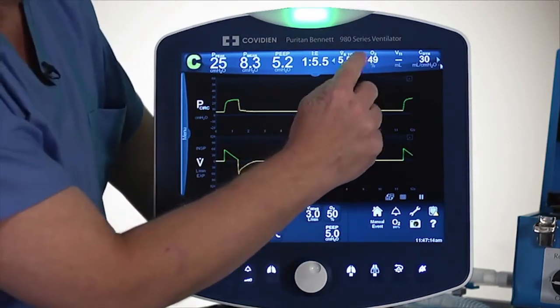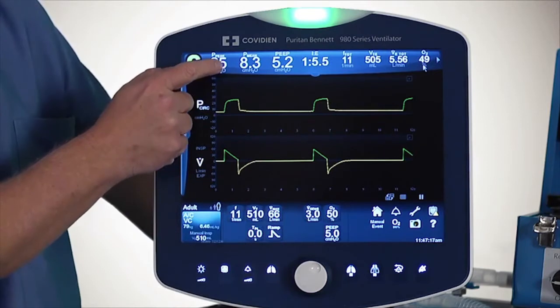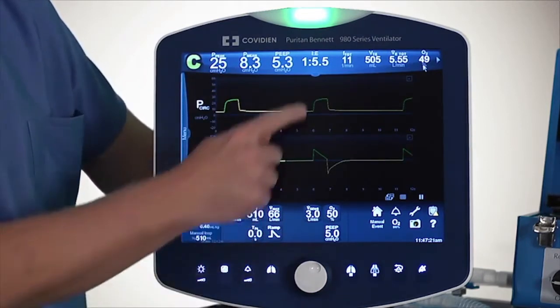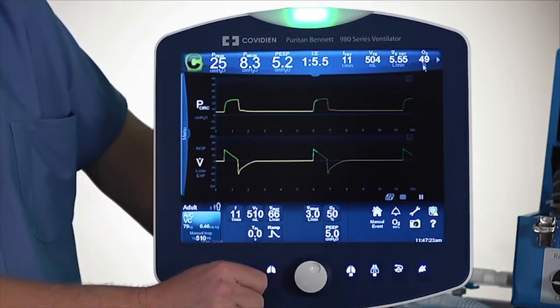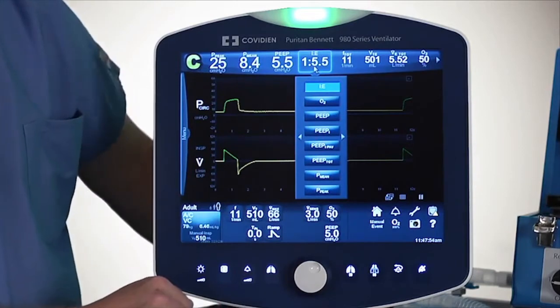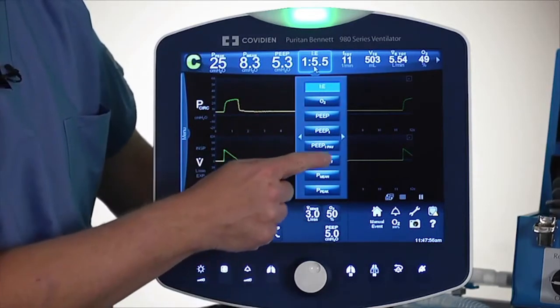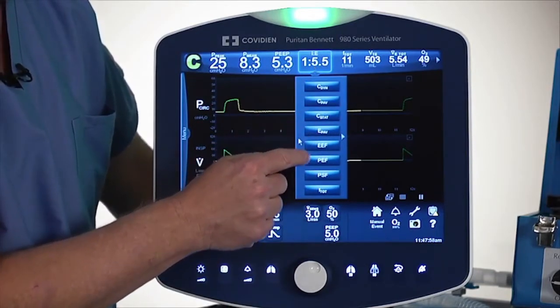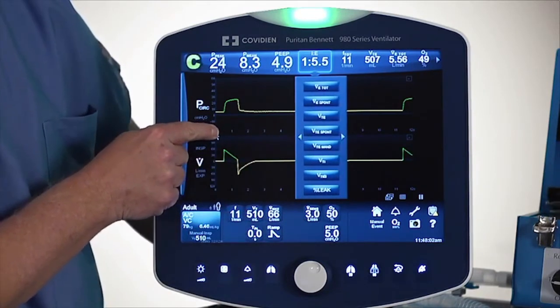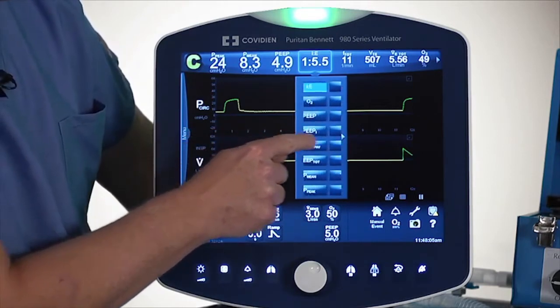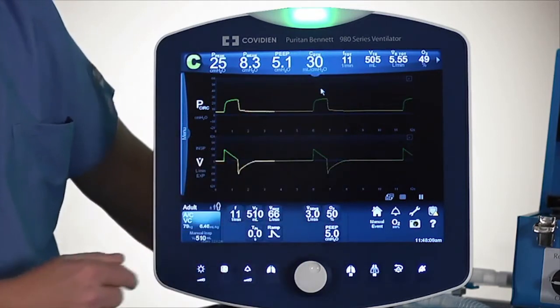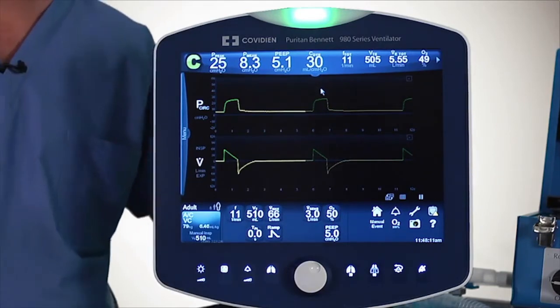The other part about the configurability is that I can actually double-tap and change what is viewed. For example, you may decide that the IE ratio is not the most important thing to look at. You can use the arrows to go left and right, or you can just drag it with your finger and decide what you want to view. For example, I will switch it to compliance. That is one example of how you can customize that upper screen.